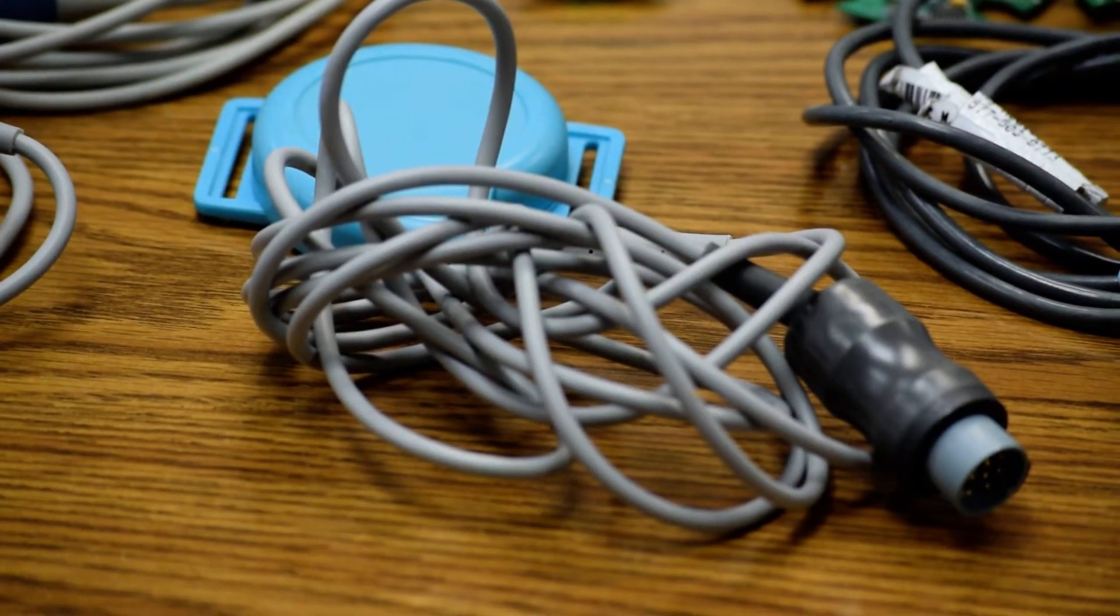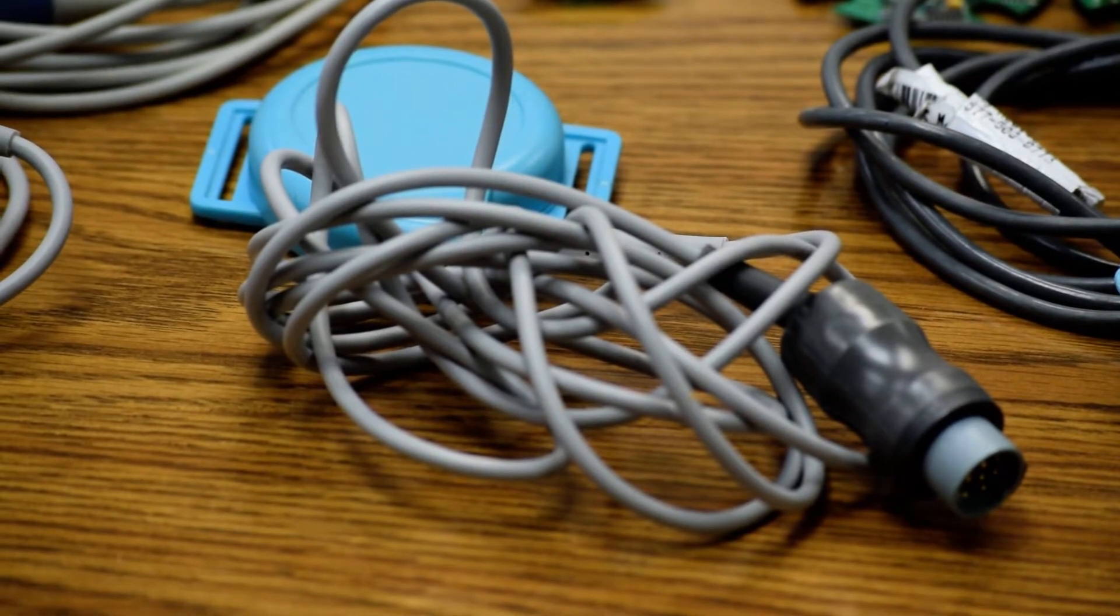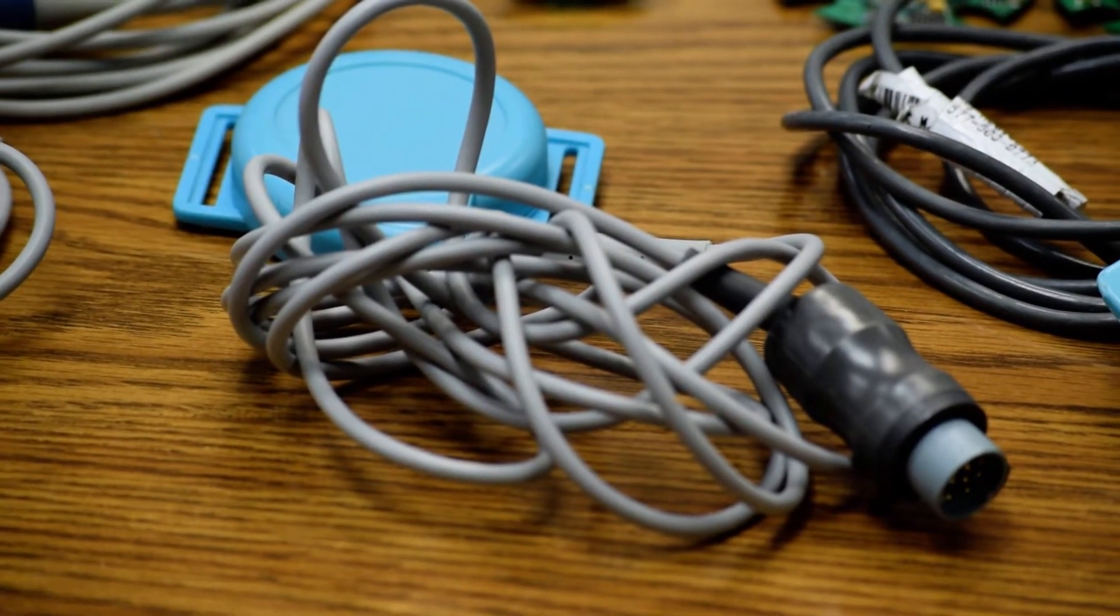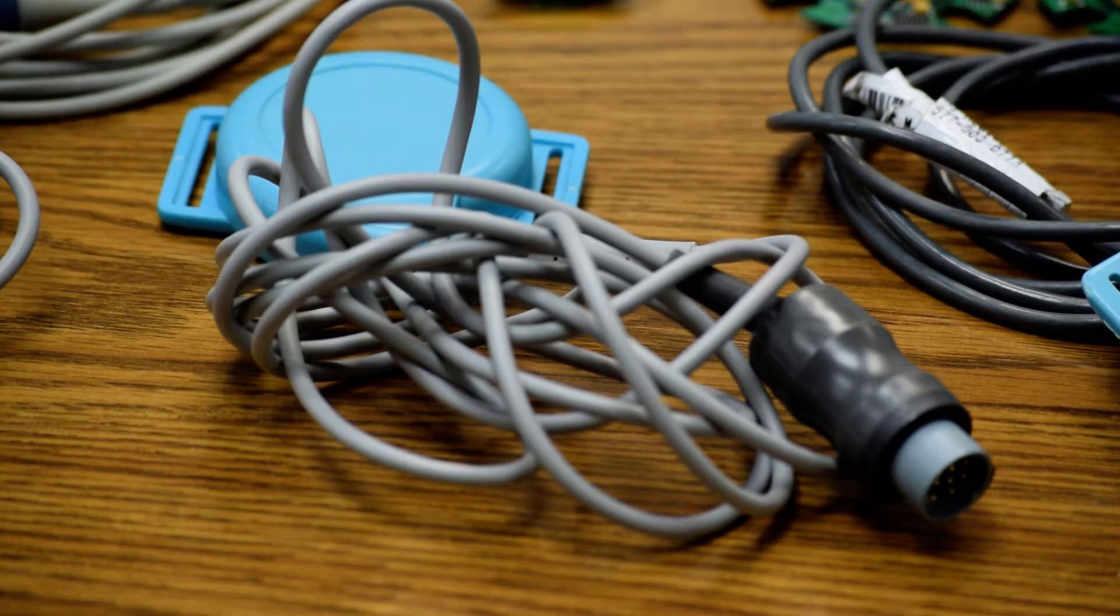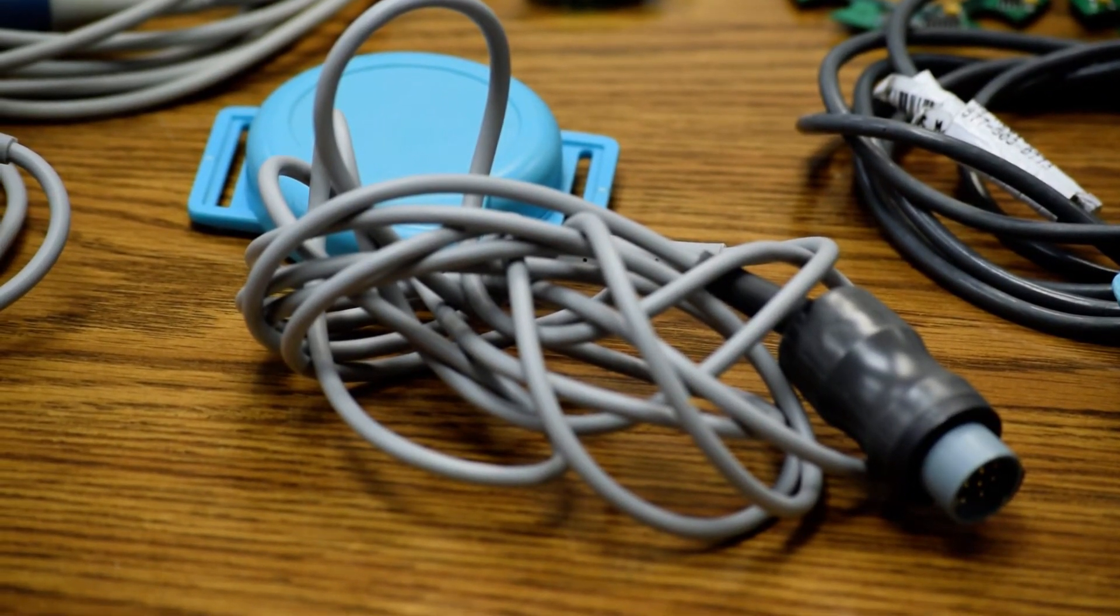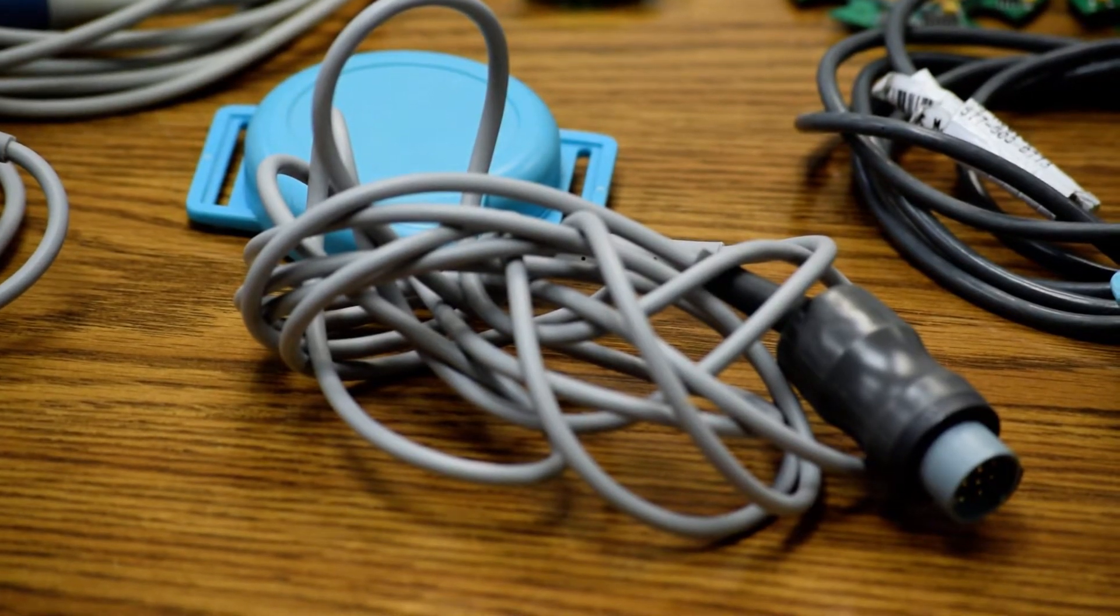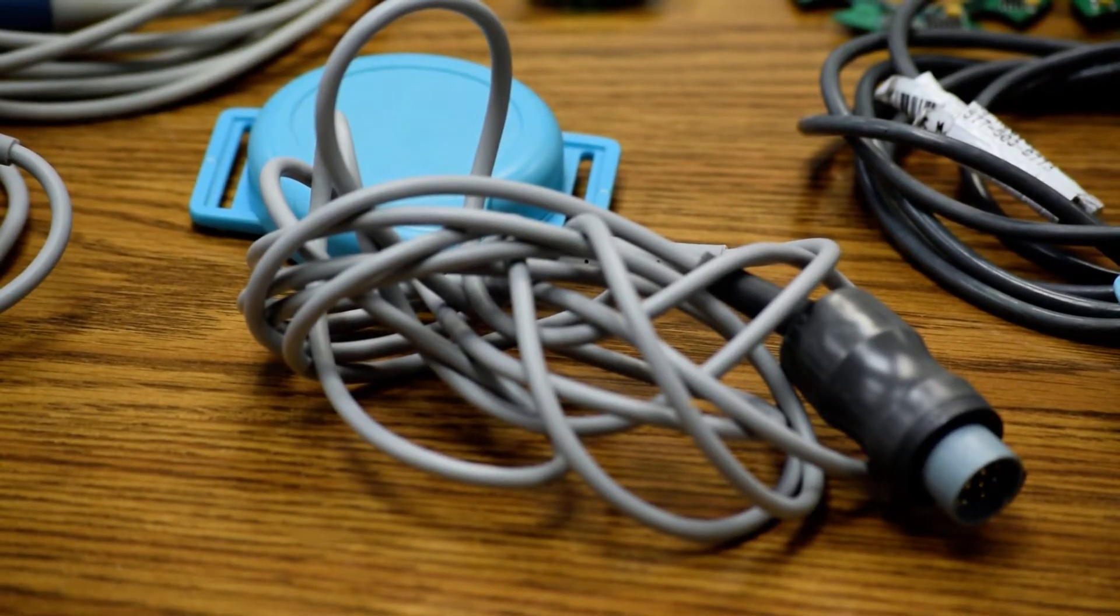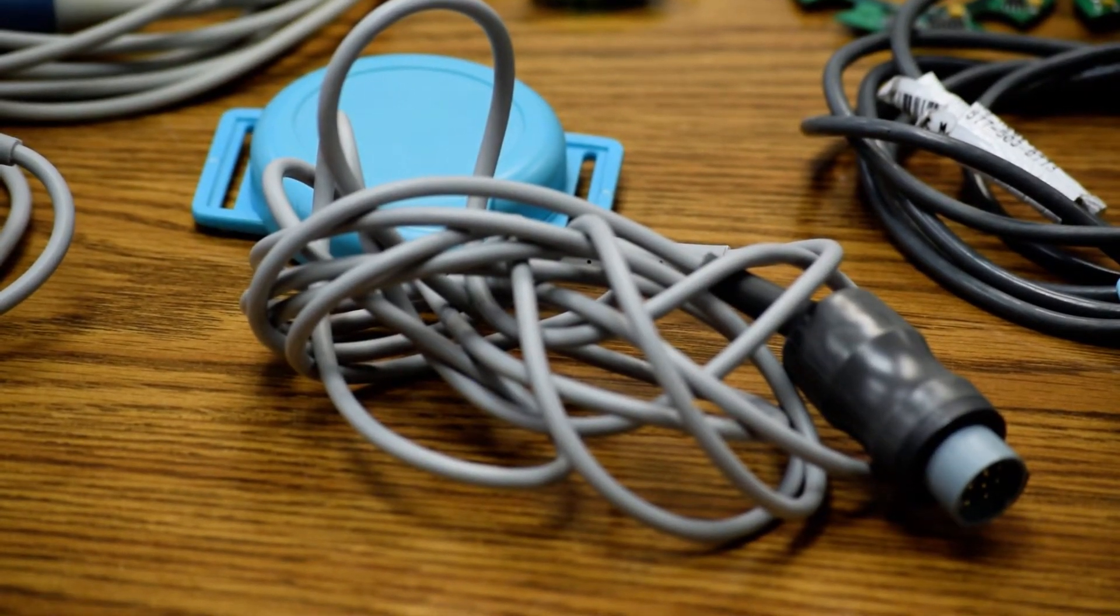Welcome to TOCO expert channel. One of the complaints from hospitals biomedical engineering department purchasing and procurement is that very high failure rate of patient cables.